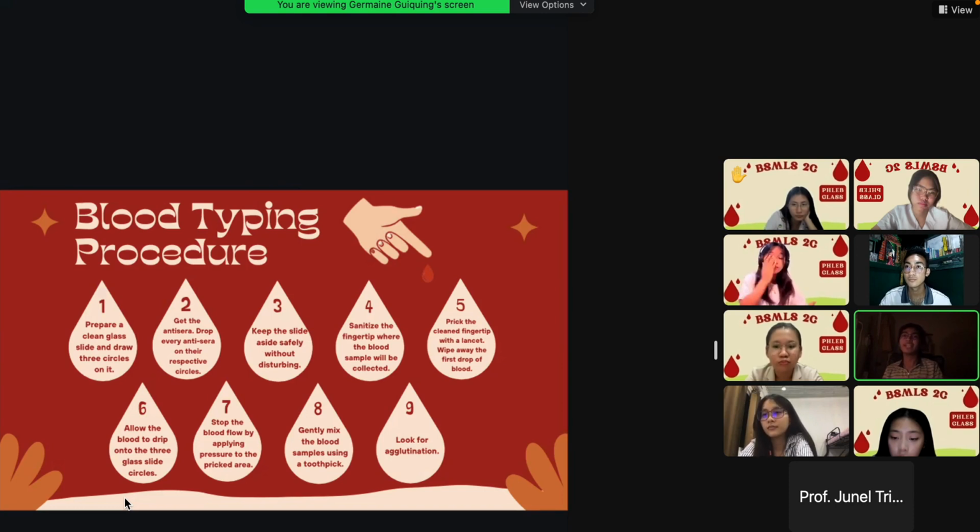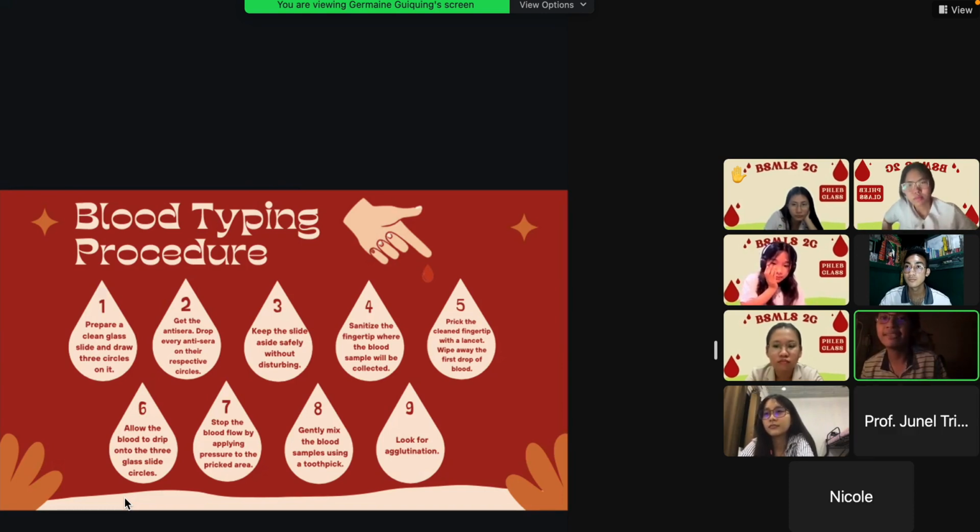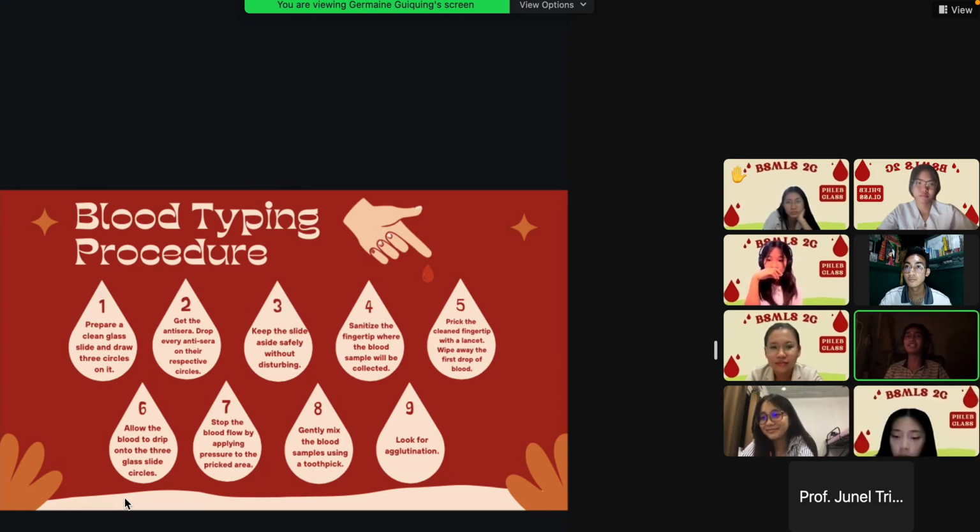Something like that. Okay? So next is get the anti-A, anti-B, and anti-D, and drop every antiserum on the respective circles. Guys, hindi natin i-drop yung tatlong antisera sa isang drop of blood, okay? So kunwari anti-A is dun sa first drop of blood, second drop of blood is the anti-B, and then the third drop of blood is for anti-D. Next is to keep the slides aside safely without disturbing.